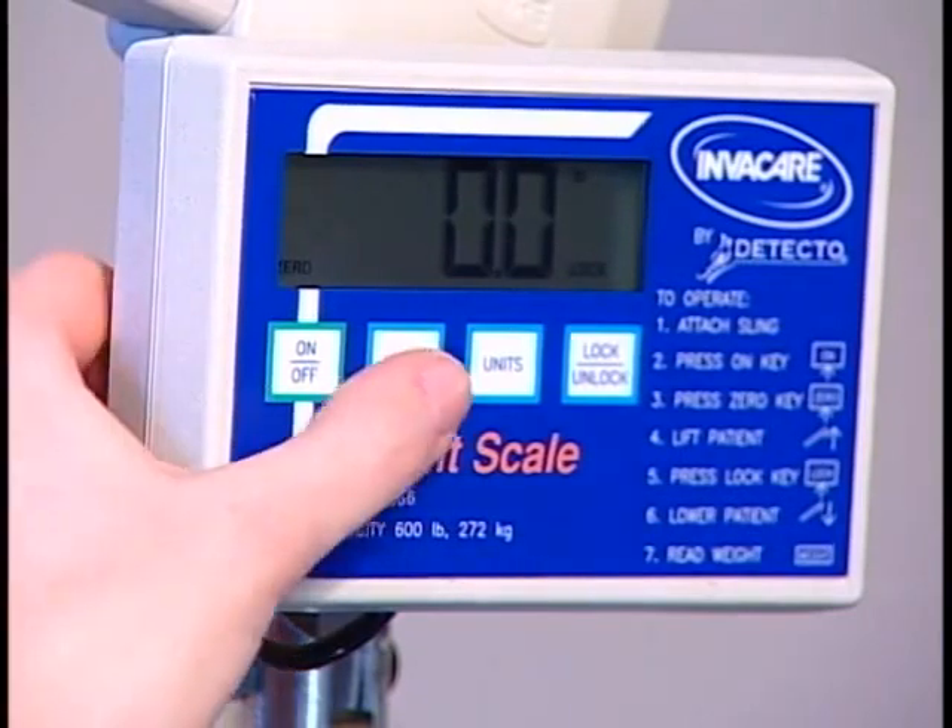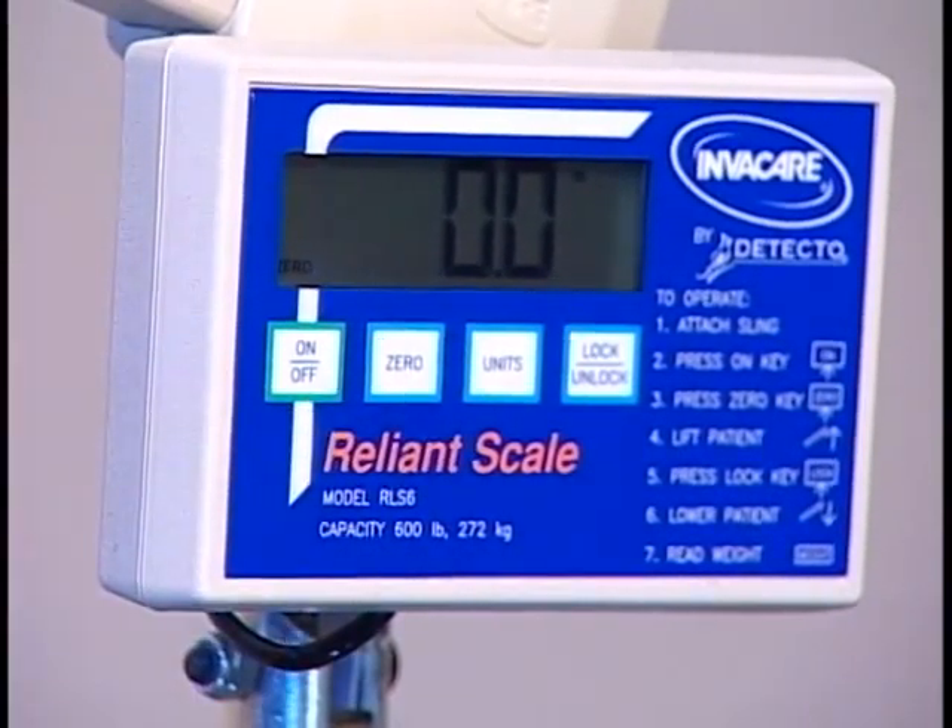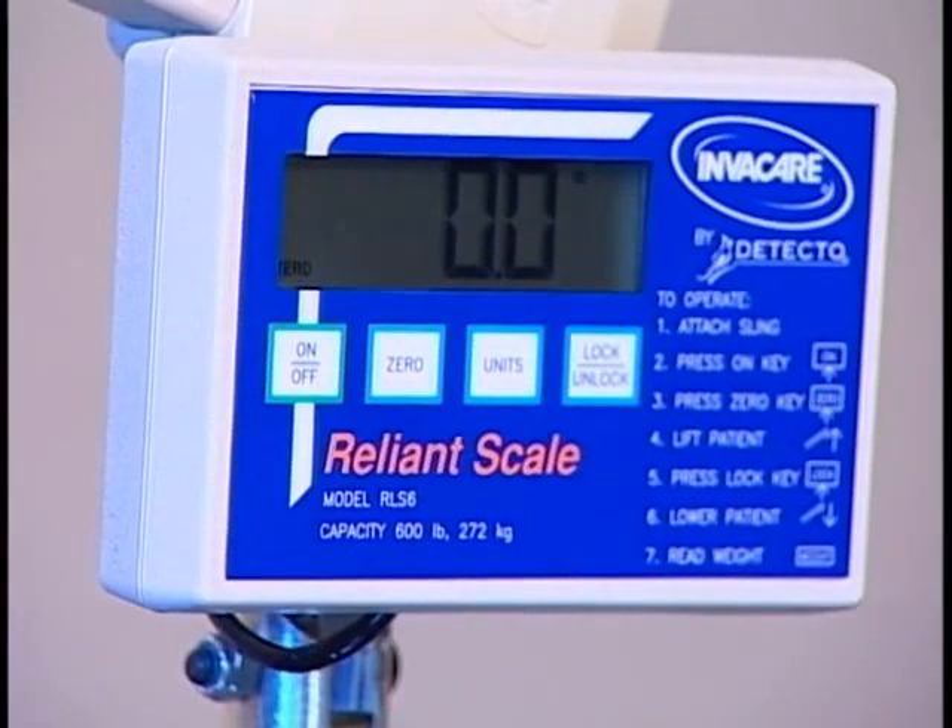Press the ZERO key. The word ZERO will appear in the display window. The scale is now reset and ready for use.